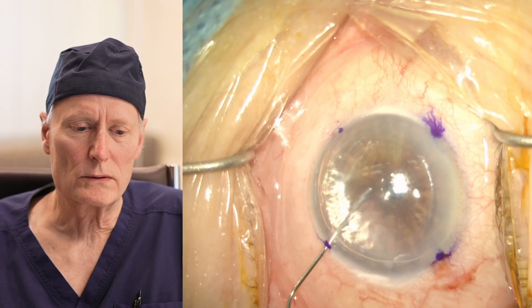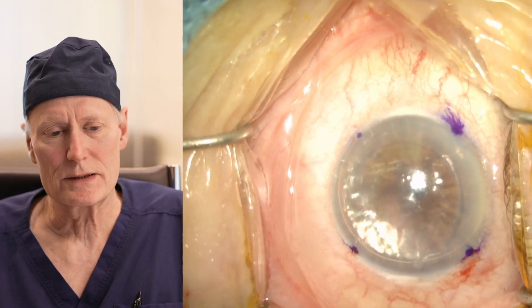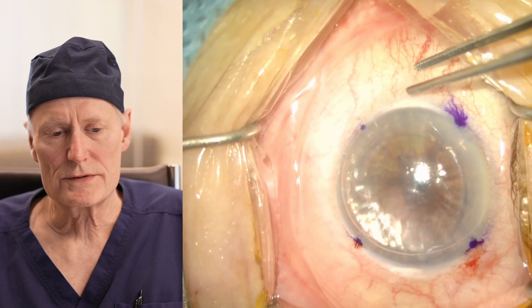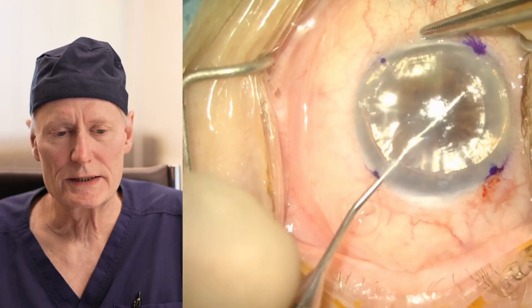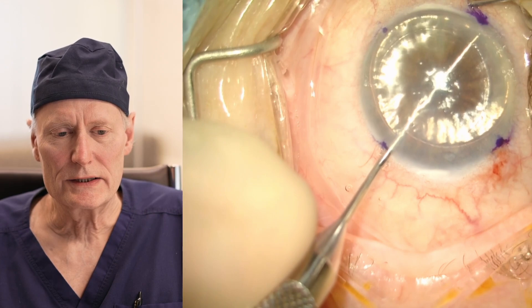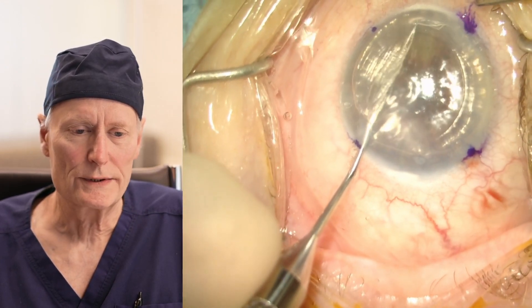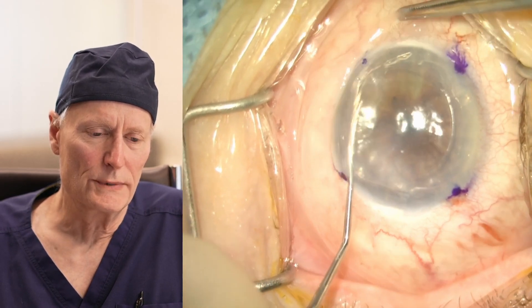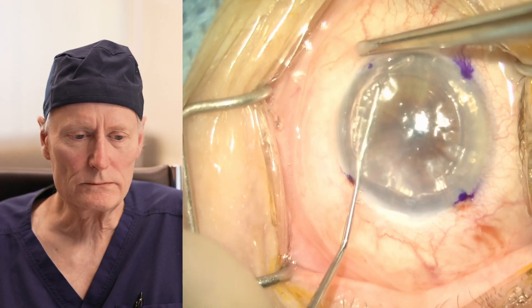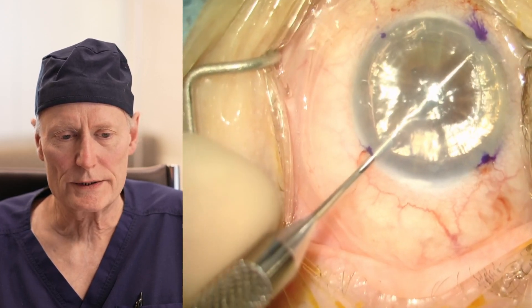Not only does the air support the cornea, but it also lets us see the cells on the back of the cornea that we're going to replace. It gives us a better view, and the air provides some surface tension so that the inside of the eye can be accessed and manipulated more easily. So the view is better, the manipulation is better, and we always use air for this first part of the surgery.